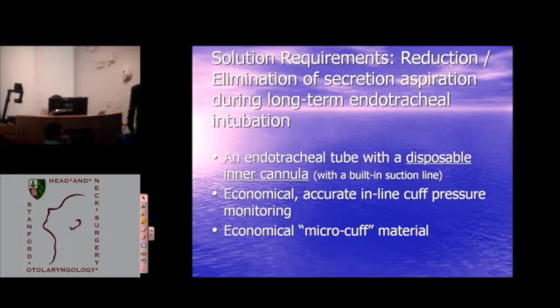So we plan to put that cuff as part of a staged program on our trach tube and endotracheal tube. When you put trach tubes in people, some of you probably get a syringe, bring up the cuff, and listen with a stethoscope. You may squeeze the pilot balloon, which has been shown in studies not to tell you anything. So we have figured out a way to replace that little pilot balloon with a digital gauge about as big as my thumb, backlit, so you see 1, 2, 3, 4, 5 until you get to that 20 to 25 range, so you know what you're putting in scientifically.